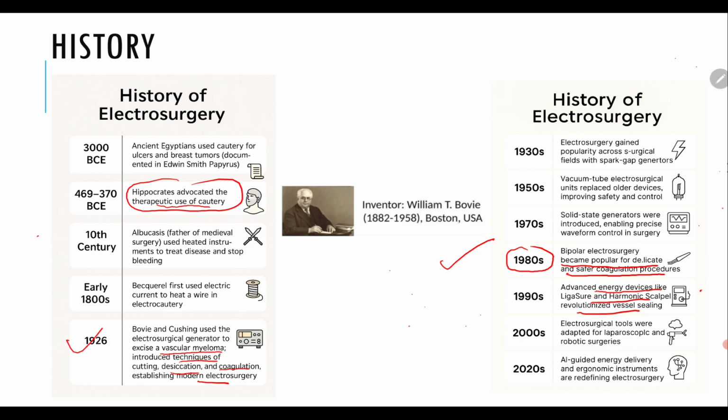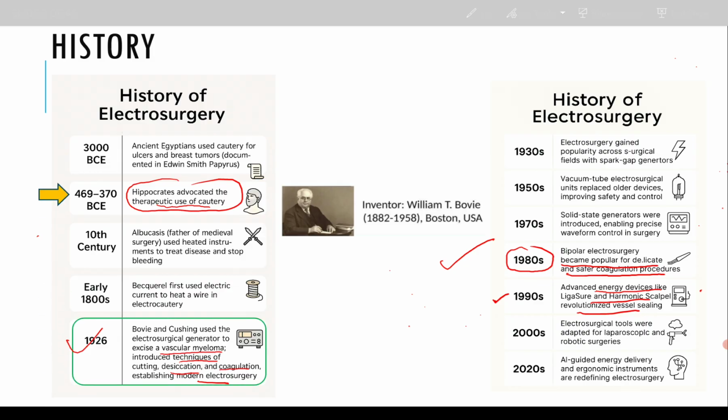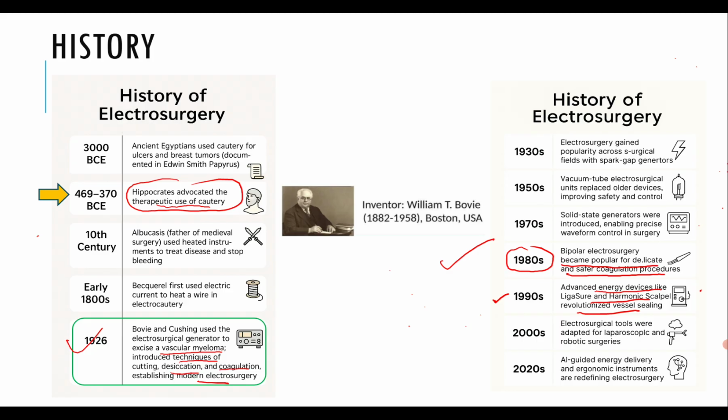Then in 1980, bipolar electrosurgery became popular for delicate coagulation procedures, and in 1990, advanced energy devices like LigaSure or the harmonic scalpel revolutionized vessel sealing.